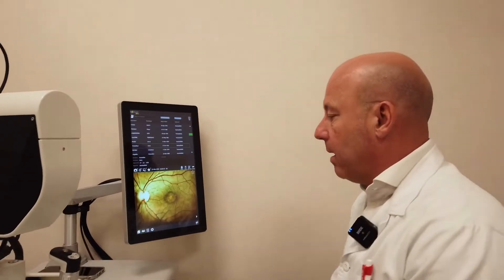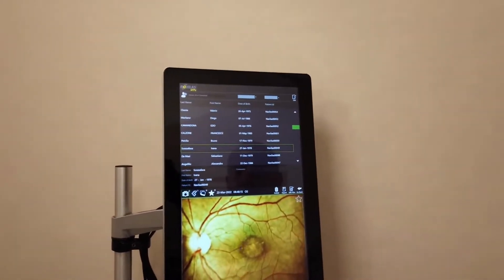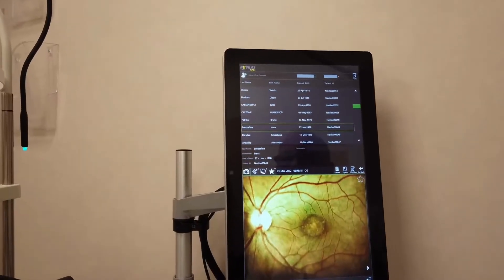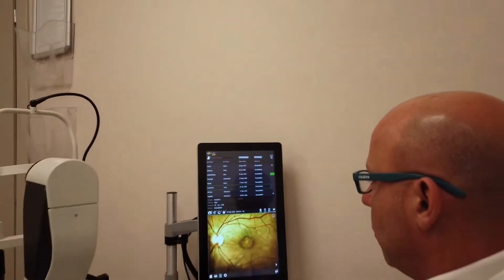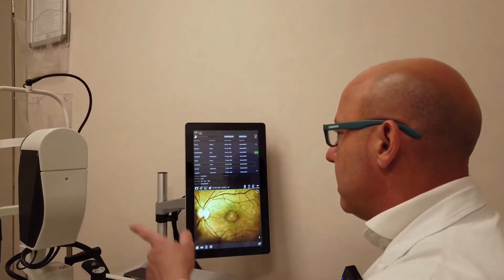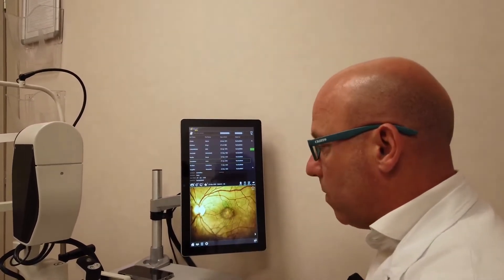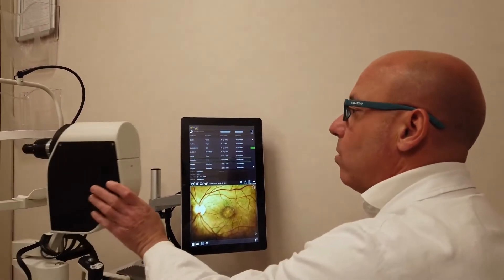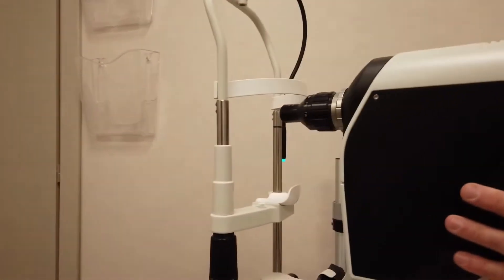We have a machine equipped with a different system than the traditional one we are used to. This machine needs the acquisition of a high-definition photo of the patient's retina. The patient sits in front of this non-contact machine, so you don't put a lens on the eye, but the machine acquires the patient's photo without having to touch them through this optical system.